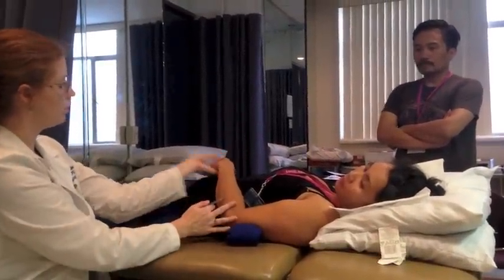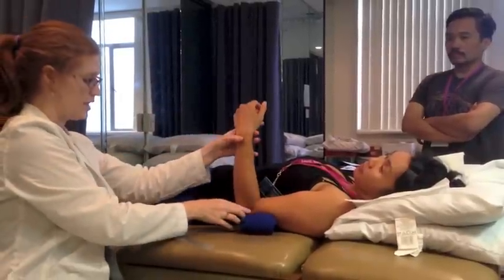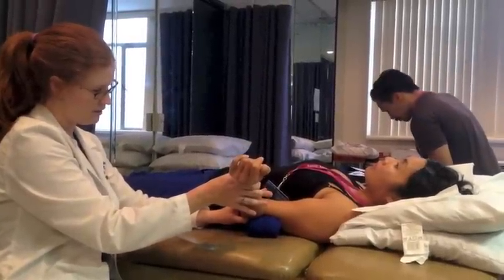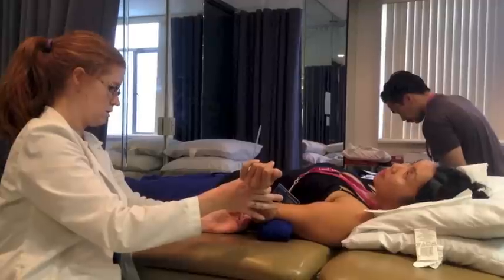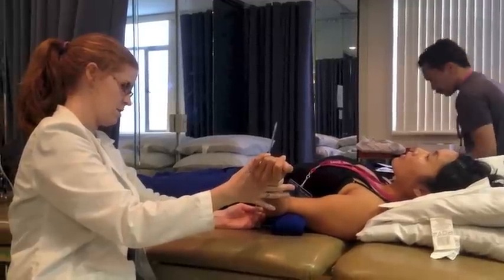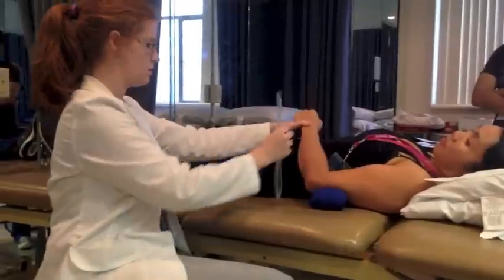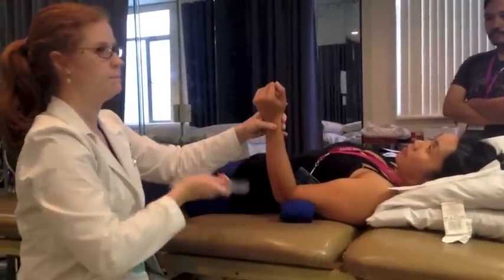I'm going to get her arm back in resting. We guessed a little bit around 70-ish. I'm going to take her back into this position, making sure the humerus is not abducting. It would make more sense to not have my arms crossed, and then I can let go here — as long as I don't let the humerus move — and grab my goniometer. And 60. Then I'm going to bring it in, and it can just rest on her stomach. 44.